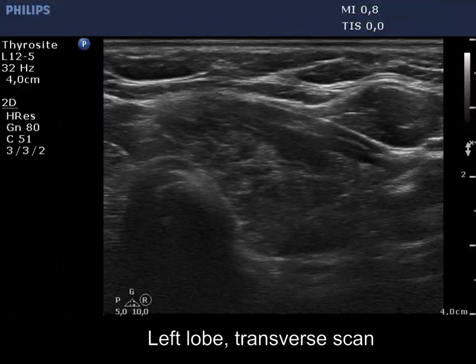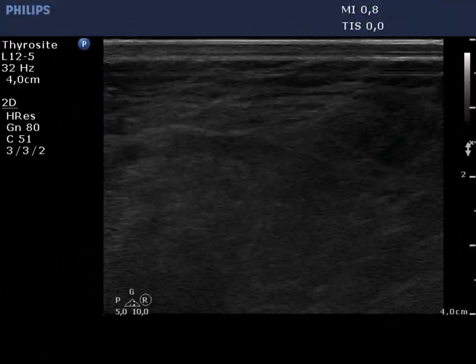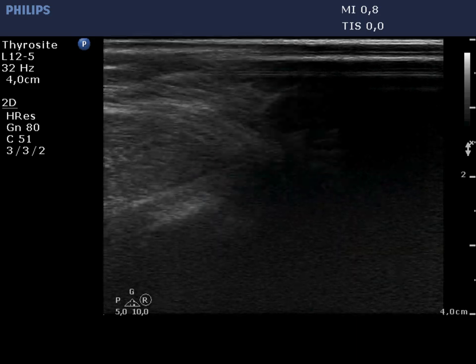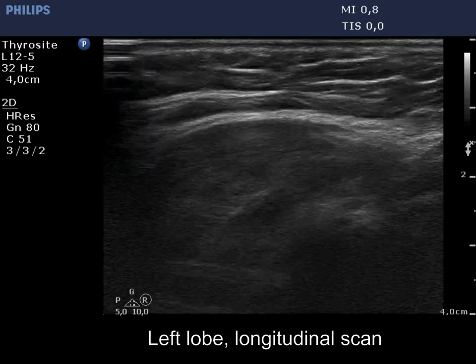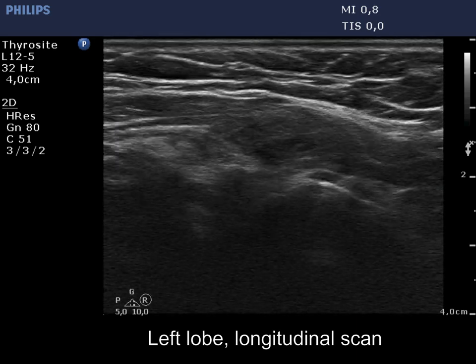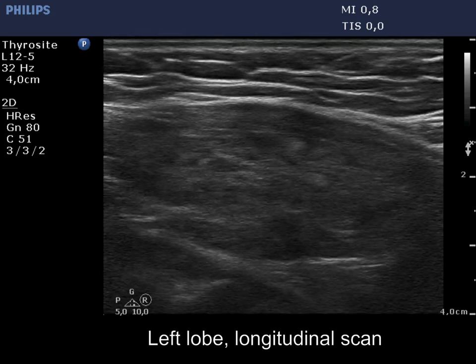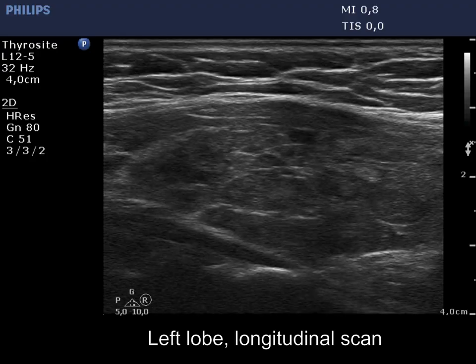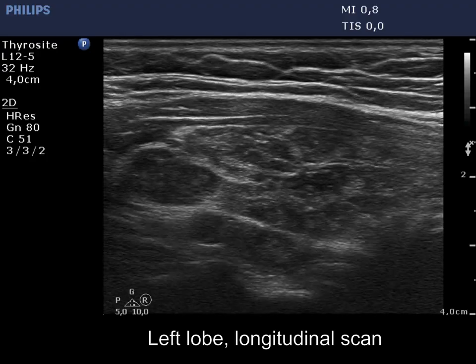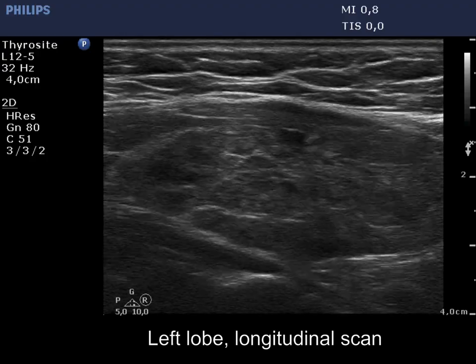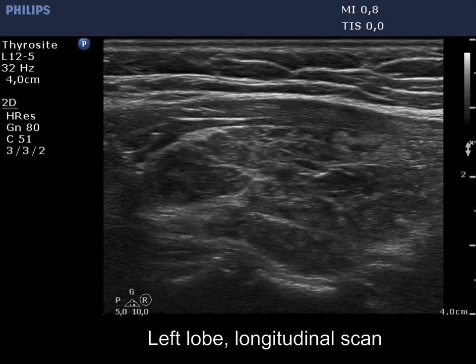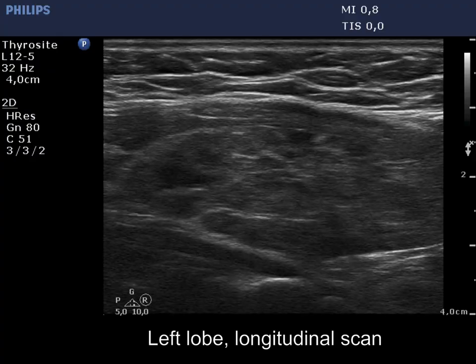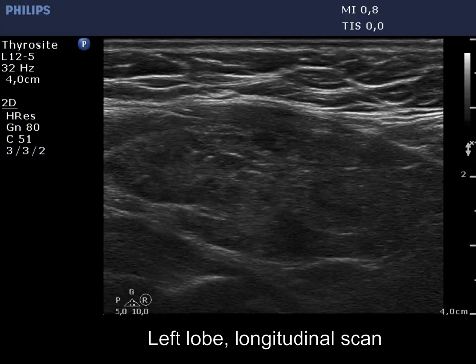The left lobe has a similar appearance. Note the presence of connective tissue in the form of synchronous presence of echogenic lines and granules. The discrete lesions have irregular borders.